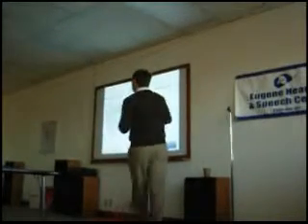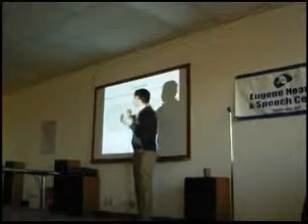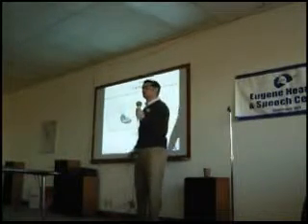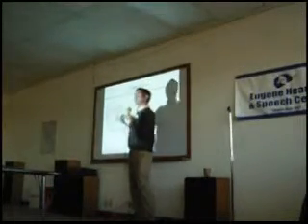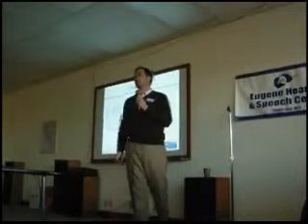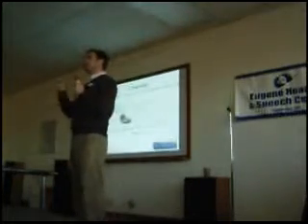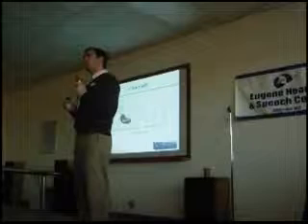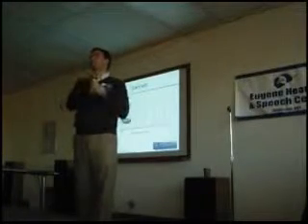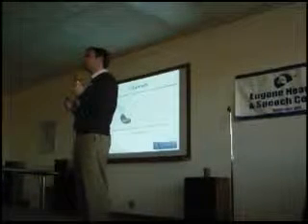So in this case, more channels will allow the hearing aid to have greater definition, because it can work with probably 80% of this sound as an individual sound, compared to where here it's only working with this, it's not working with this one much at all. So having more channels allows the hearing aid to provide better definition of sound. It can work differently in background noise situations. It certainly is going to give the clinician a lot more ability to fine-tune that hearing aid, which will then benefit you as well.